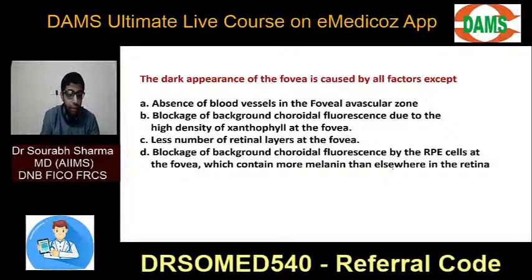Piyush Kumar, in autofluorescence, the white retinal flecks, that is lipofuscin deposition. In angiography, the background is dark because it is blocking the dye.